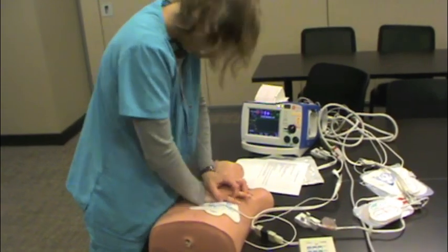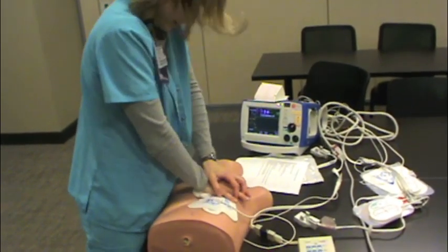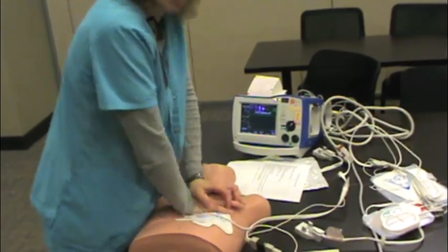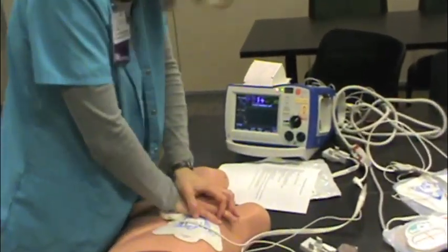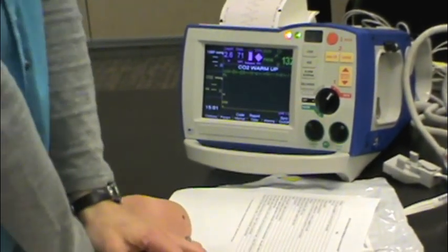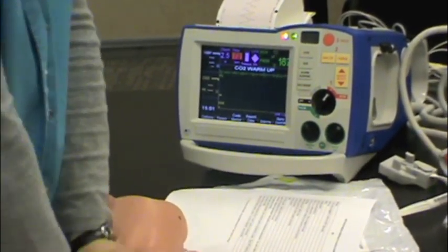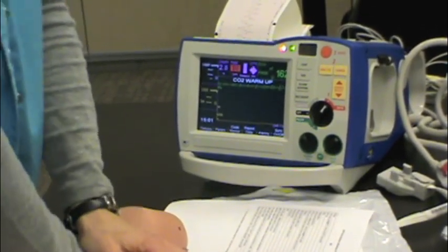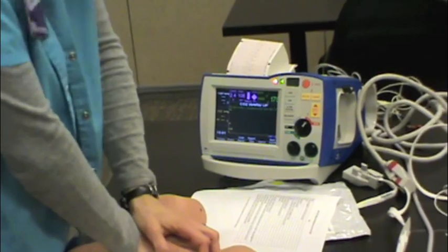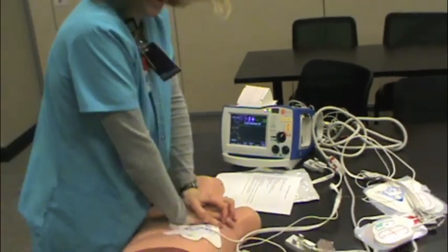The machine will give you real-time CPR feedback. If you're not pushing hard enough, it reminds you to push hard. If you slow down too much, a metronome reminder tells you to speed up. As long as it's quiet, you know you're doing a good job.